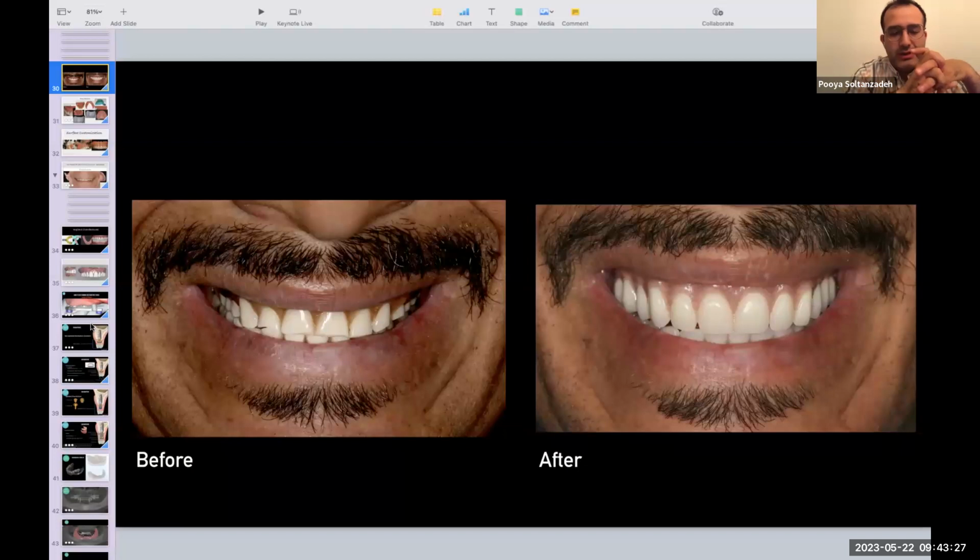So nowadays there are a few companies making 3D facial scanners. Basically they consist of multiple cameras. Actually, I have it in my office. We can FaceTime you another time and I will show you how it works. They have around 10 to 12 cameras all around the face, with big wings, and it takes a picture. It captures all the landmarks, for example the Frankfurt horizontal line, and merges that to the intraoral scan. If you scan inside the mouth and you have that facial scan, and then you have a CT scan of the patient, it merges all these three data together, and they give you a rough idea.